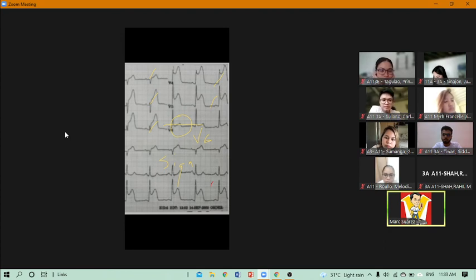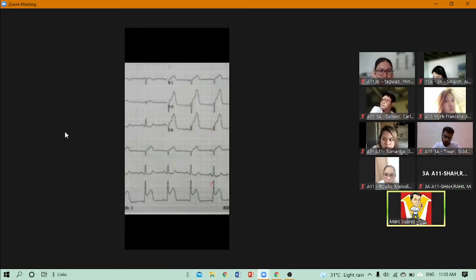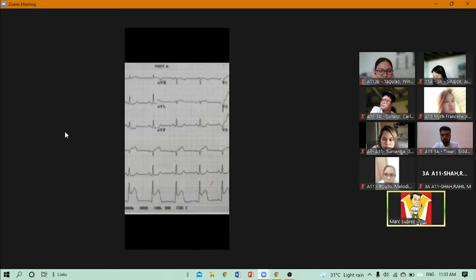So my assignment for you is, one. What is a significant J point elevation?